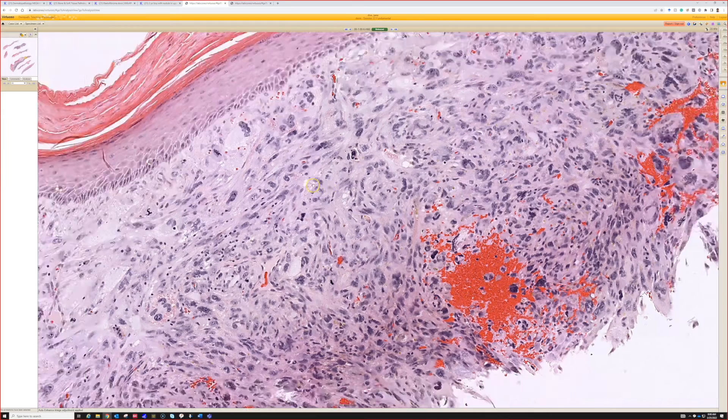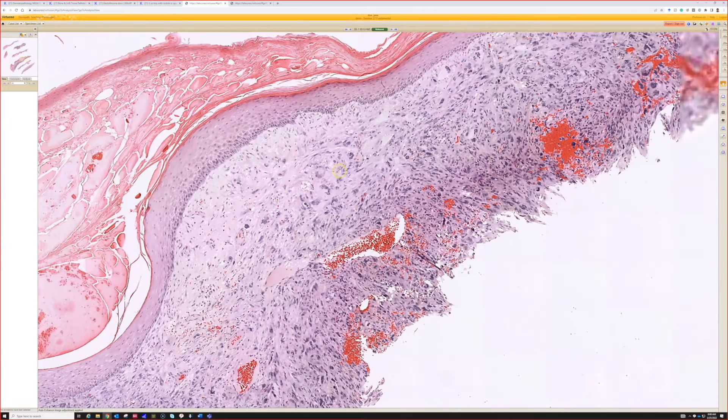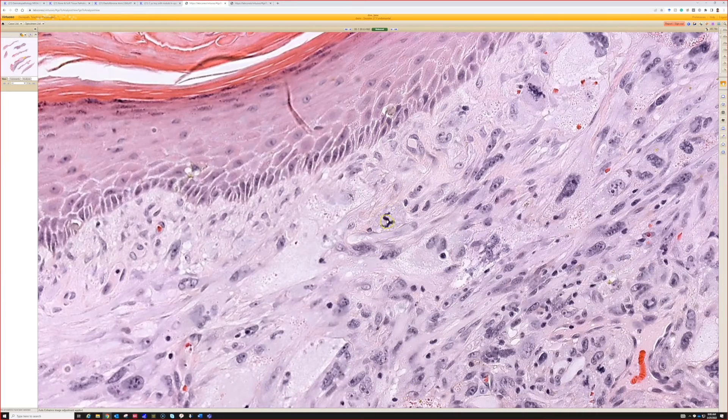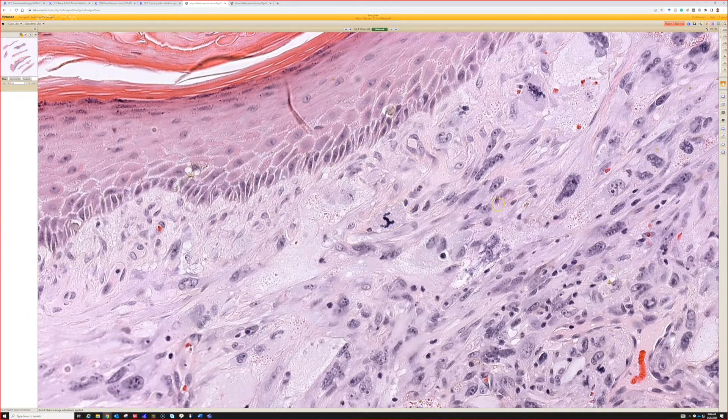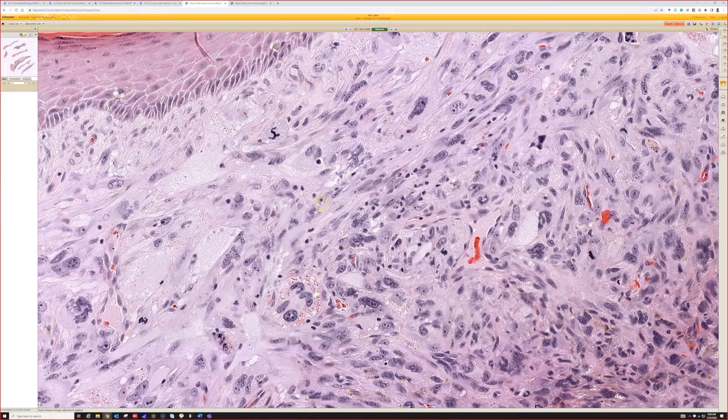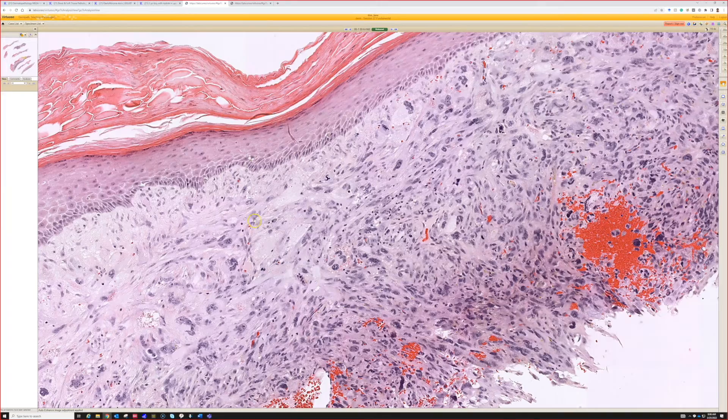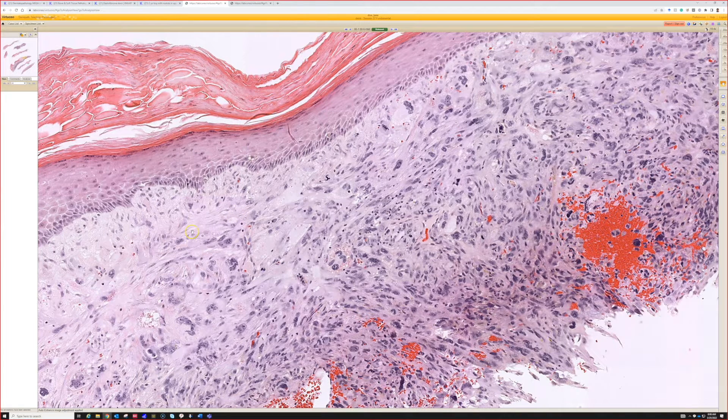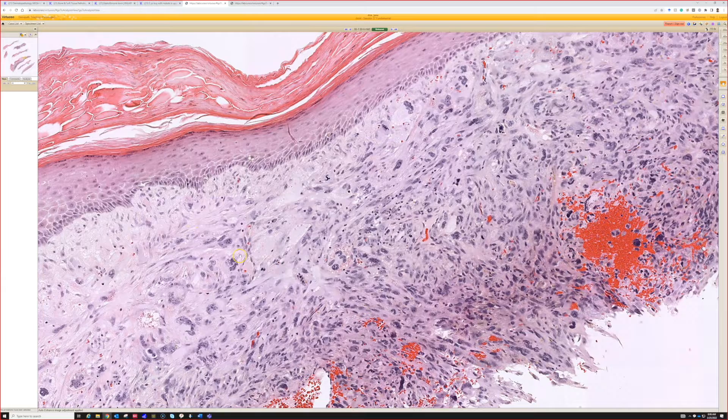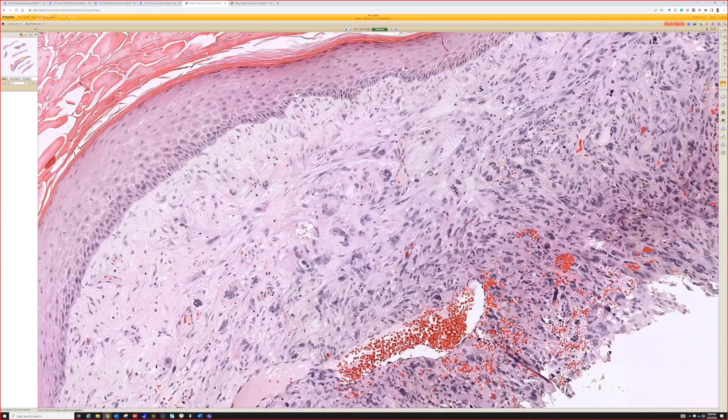Very good. Yes. So the slam differential, very nicely explained, Raheel. Oh, look at how atypical that mitosis is. Whoa. It's like a lambda or something. So the typical situation here is this is an erythematous ulcerated, sometimes crusted, not always, but sometimes erythematous papule or nodule usually on the head and neck of an elderly sun damaged person.